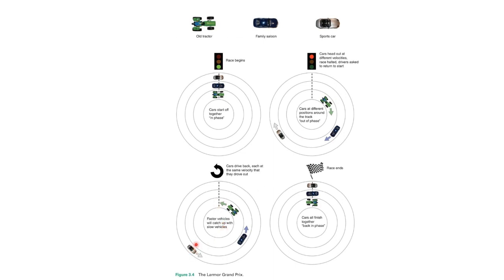If we apply a 180-degree RF pulse and tell them to reverse direction, they'll be moving at the same speeds, so they'll reach the same point again at the same time. So we'll get a higher signal again, and we can capture the signal. This is called spin echo because we are using the spin and reversing the spin.